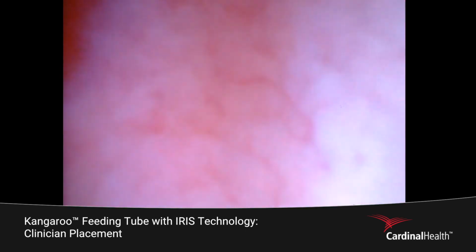Right there, that was the pylorus. So that's a perfect shot of your pylorus. And then if I advance back there, you see it shift back to small intestine. See if I can see it make the drop again.